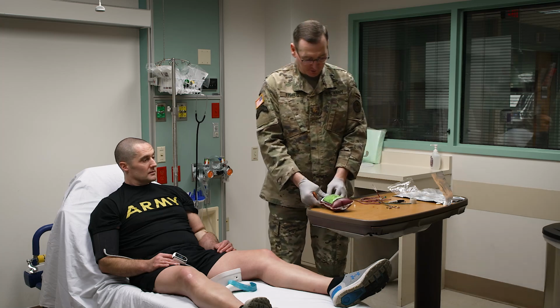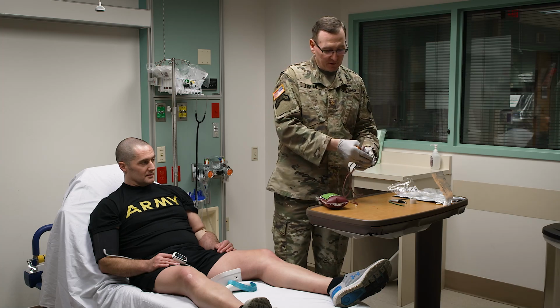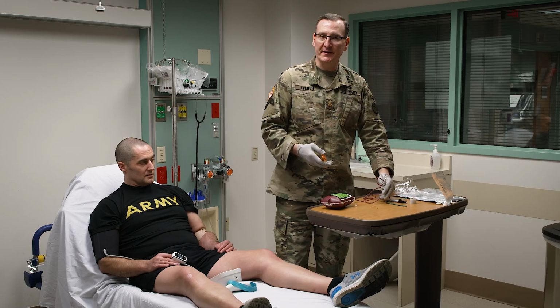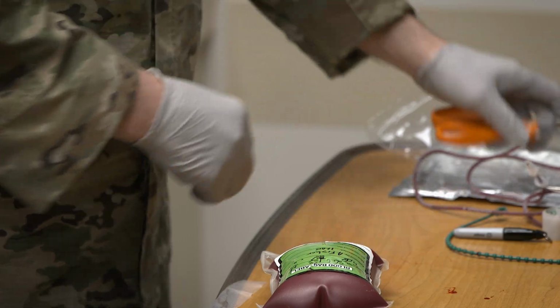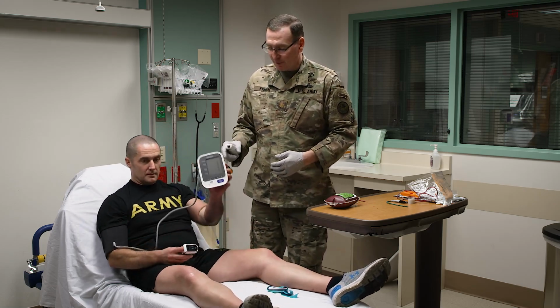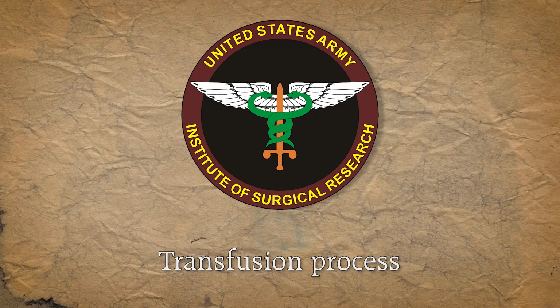And our final thing we're going to do is go ahead and cut between these 2 knots. You'll notice that the blood is left inside of the line here. Previously, it was thought that it would be best to let this run through. However, now it's probably best to just leave that in the line, tie your 2 knots, and then cut. And finally, we're going to take a last set of vital signs for our donor here. That includes, again, a blood pressure, a pulse oximetry with both pulse and SpO2, and our temperature.